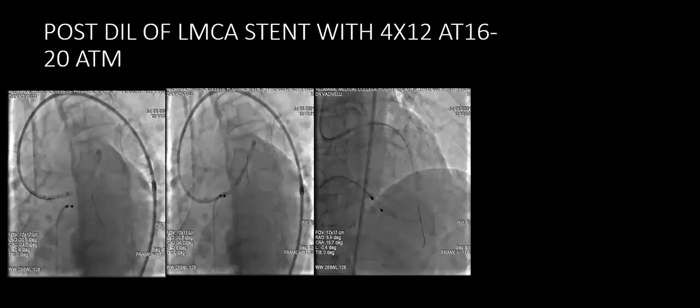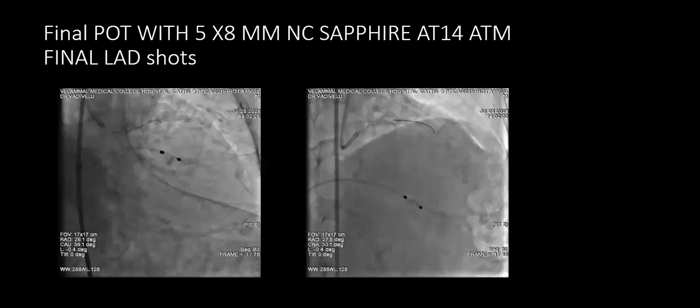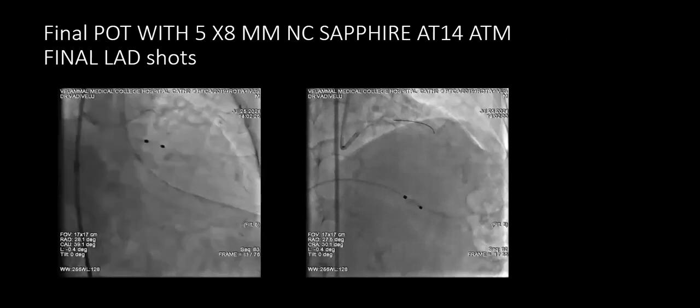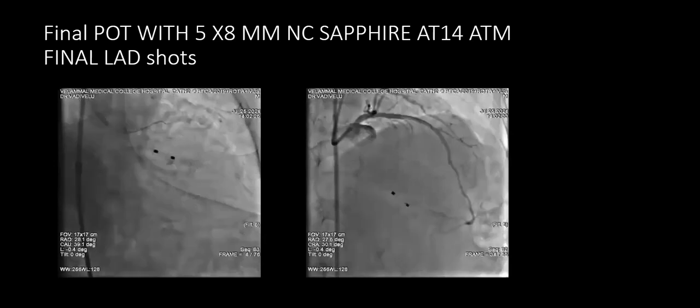And you can see here, refined post dilatation was done with a 4 into 12 mm balloon at 16 to 20 atmospheres. And the post dilatation IVUS was done, whose findings I will share. And the final part was done after the IVUS. It was noted that in the left main, the 4 alone is not enough. So I took a 5 into 8 mm NC Sapphire, and at 14 atmospheres there was a satisfactory result. You can see here the result is really good.